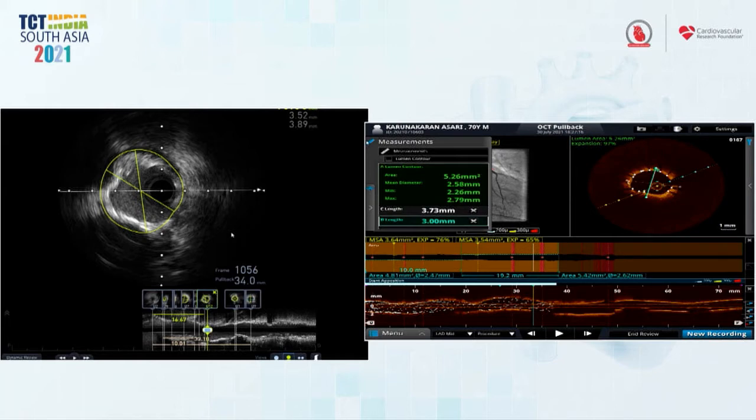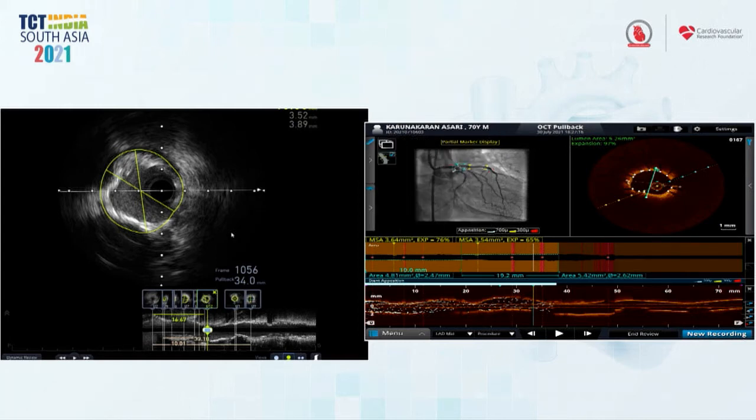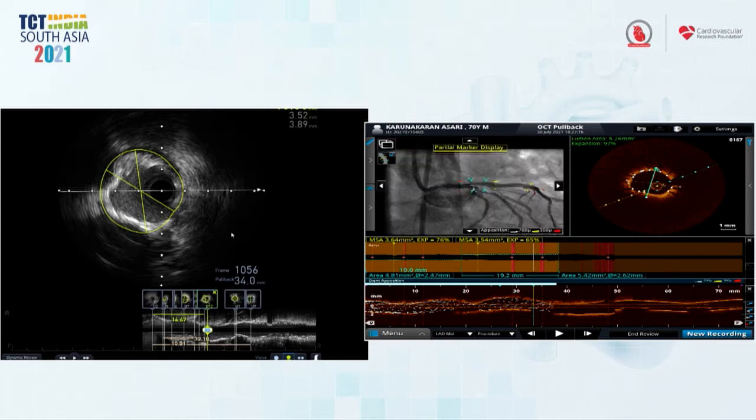And conceptually, what we're trying to do here is create some tears behind the stent. Not a perforation, but this is fibrotic, really densely fibrotic tissue, and we're looking for some segment to yield. That's why a prolonged balloon inflation with a larger balloon is more likely to give us some extra space. So that's what we've done here.